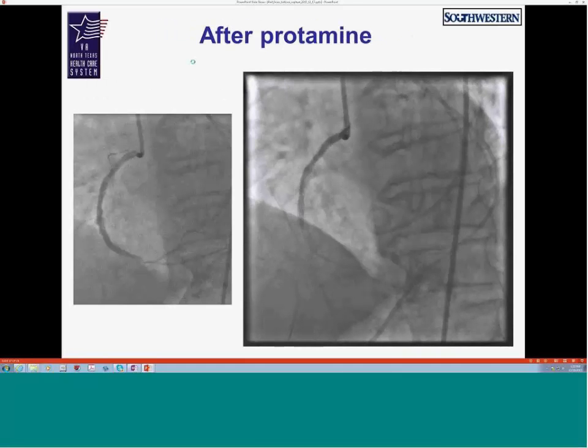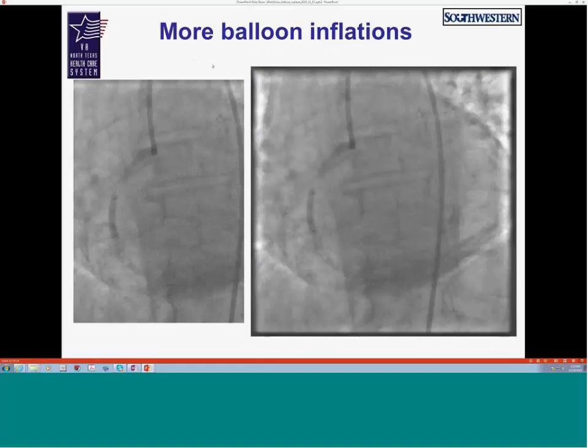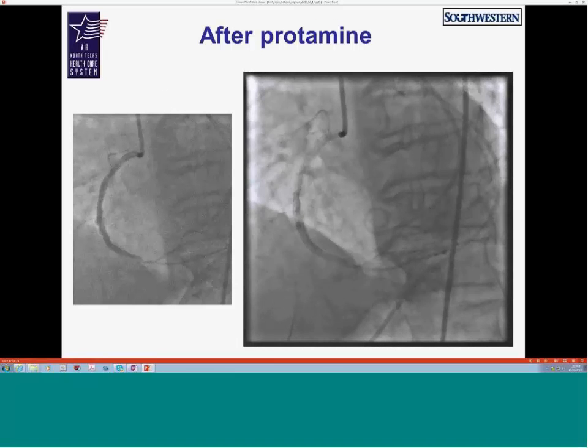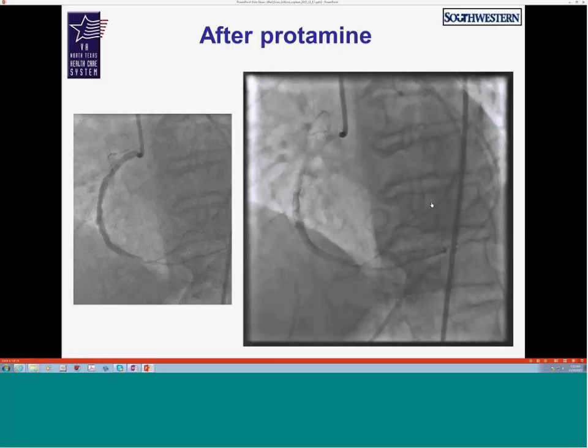So at this point, we ended up removing the retrograde guide wire. And again, we did some more balloon inflations. At the time, we had the balloon down for a little while, and he did tamponade. So we put in a pigtail. As you can see, we have a pigtail now in the pericardium. And then we reversed with protamine. And after we did that, it finally sealed.